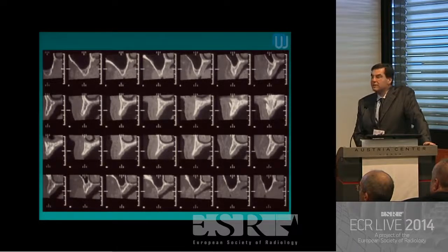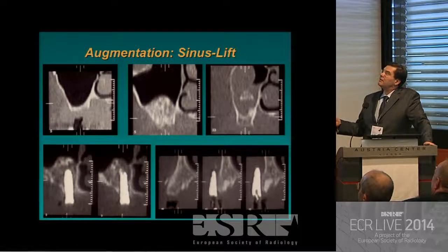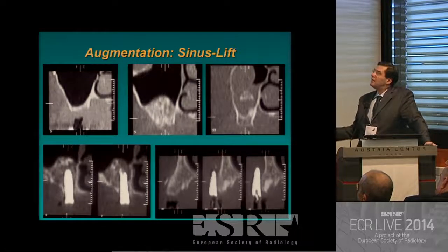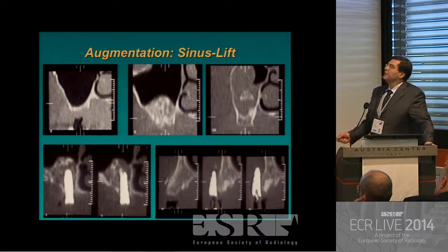When you have the atrophy, as I said before, you can fill this atrophy part up with artificial bone or real bone taken from another place in the jaw and let it grow in. You see this is a wonderful result, no sinusitis. This would be a bad result. This is a sequestration of the augmentation material, and you have a strong sinusitis on the right side of this jaw. Your goal, after having the augmentation made, is to put an implant inside and use the whole height, so the implant is completely surrounded by bone or augmentation material.